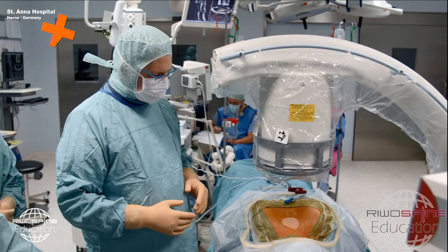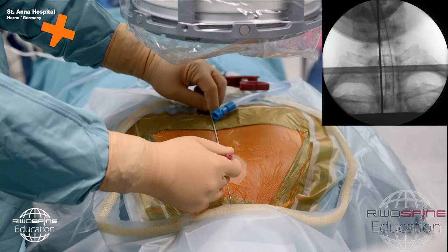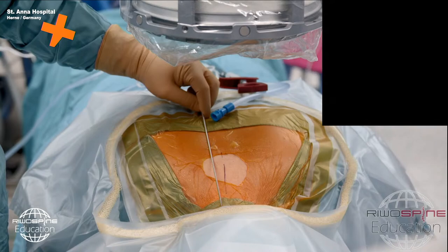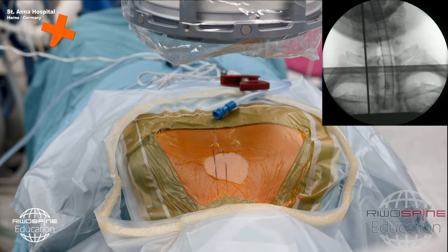So the first thing we start with, we have the patient in Mayfield clamp in prone position, and we start in AP just to mark first the midline of the cervical spine. The first line is just the midline, the line of the spinous process. And then the second line is a line in the middle of the lateral mass. So we just draw those two lines. And then we change the C-arm into the lateral position.